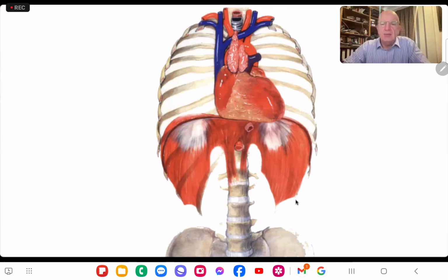That's where it is. You see the great vessels, superior vena cava, inferior vena cava, which join to make the right atrium, which sits towards the back. In front of that is the right ventricle, which sits towards the front. In front of the right-hand side of the screen, you can see the right ventricle. Behind that, you see the left atrium and left ventricle.